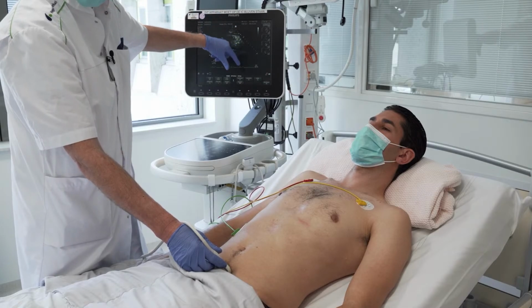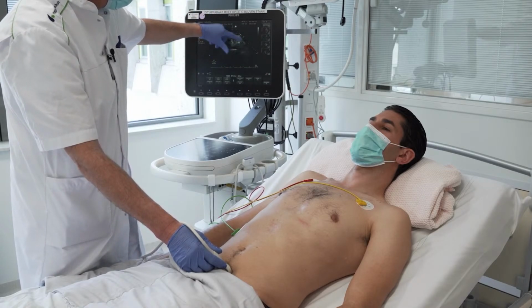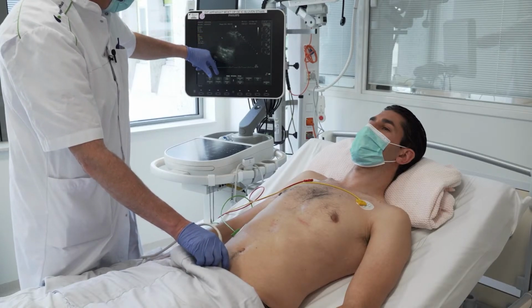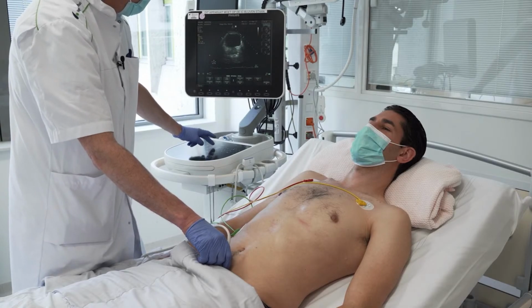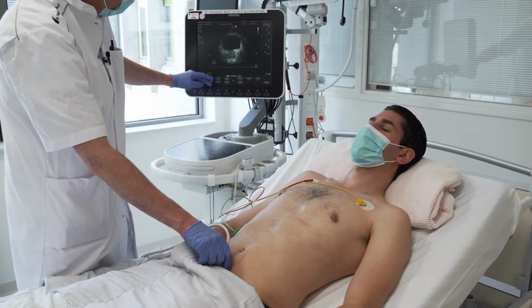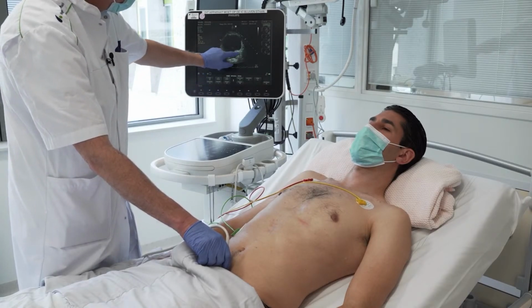We can show that on the PowerPoint later. And then in the depth you will see free fluid collections. And I think this patient, yeah, you have a full bladder, so that's okay actually. Wonderful view. This is a nice view. So this is of course normal, and with free fluid you will see collections down here.